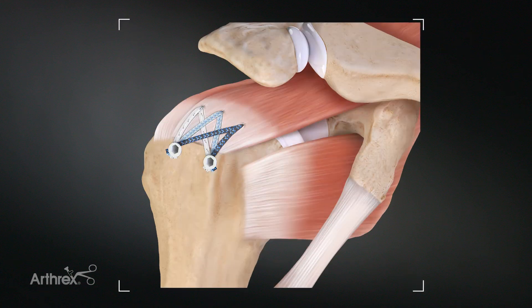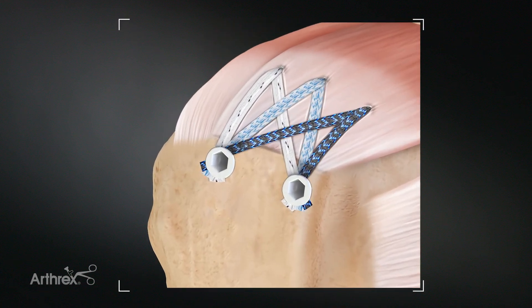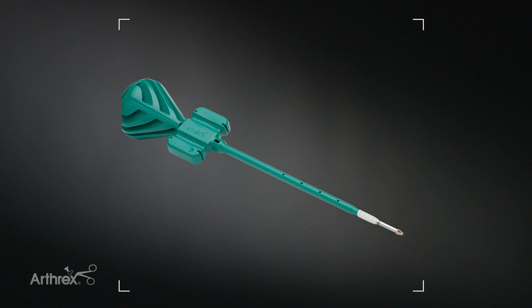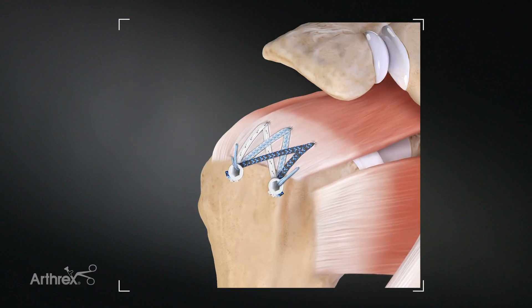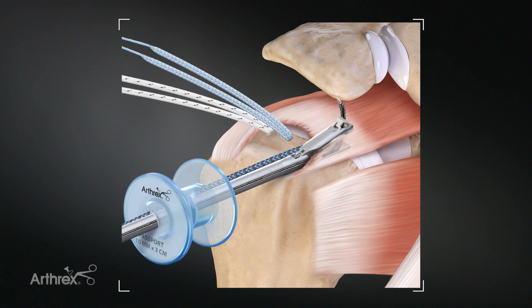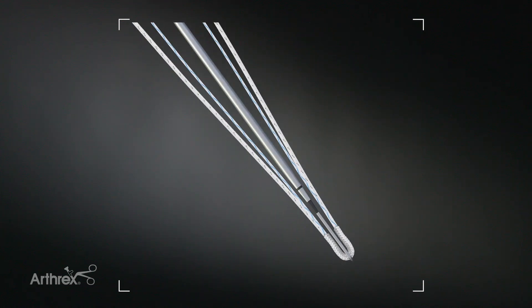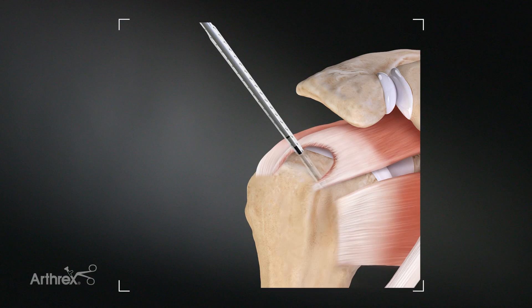Today I'm going to demonstrate a rotator cuff repair using the FiberTek Speed Bridge Construct. Laterally we're going to use the knotless swivel lock anchors, or workhorse anchor. Medially we're going to demonstrate the self-punching 2-6 FiberTek RC anchors. These anchors have a fixed fiber tape with joined tails to simplify suture passing. This is a self-punching version that can be placed with or without a guide.